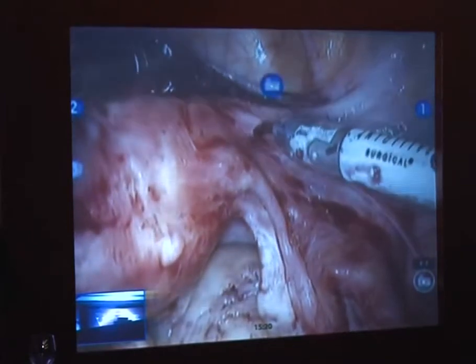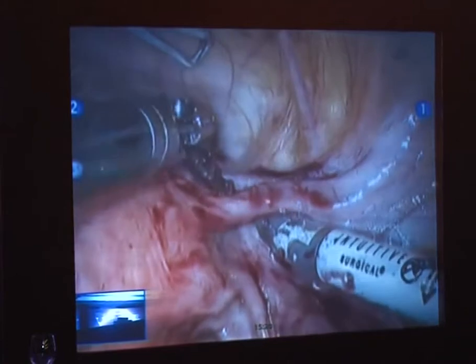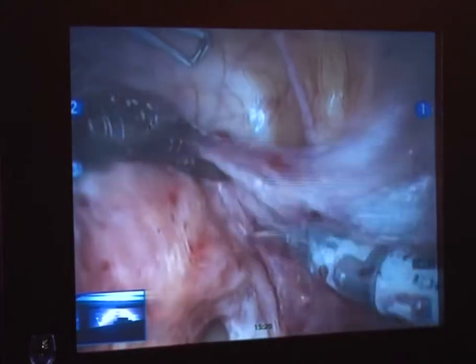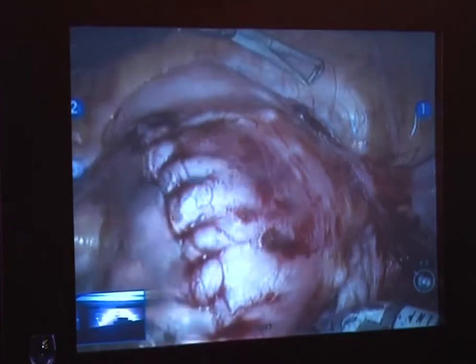Looking pretty, what's the pressure now? 8, 7, looks good. She's going to clot that off. I would leave that be. The enemy of good is better, so stop mucking around in there. You don't want to coagulate, because you don't want to get too aggressive and then get a ureter injury.